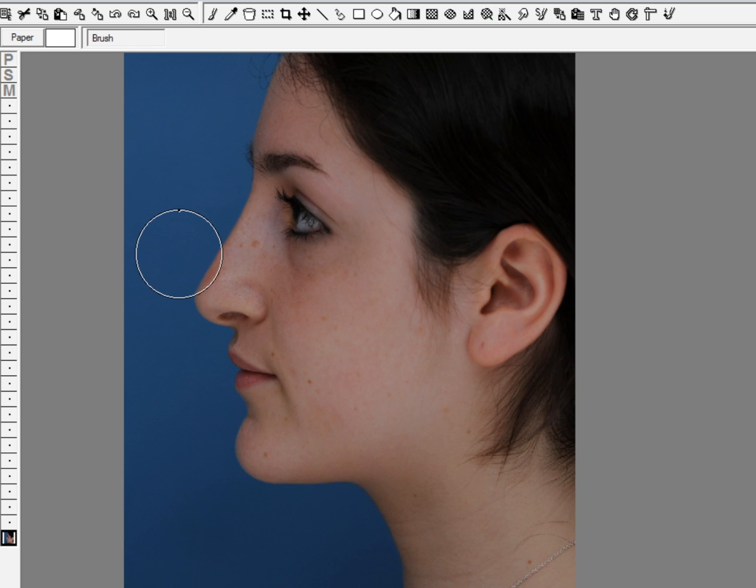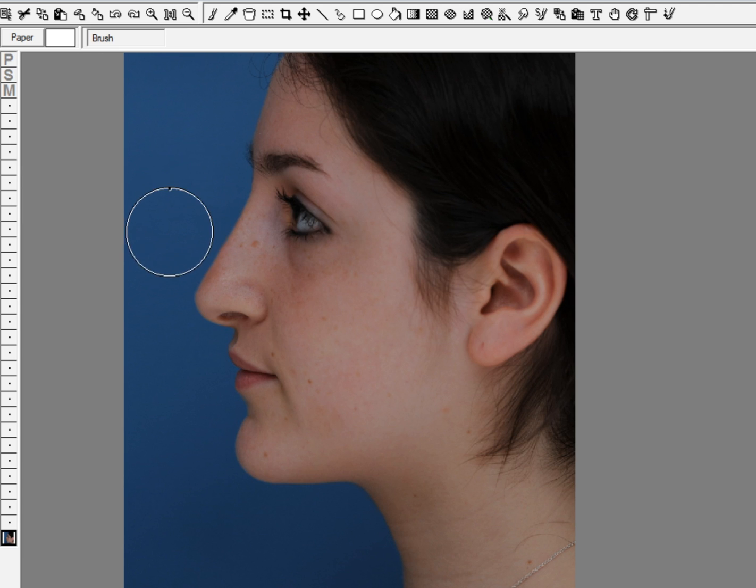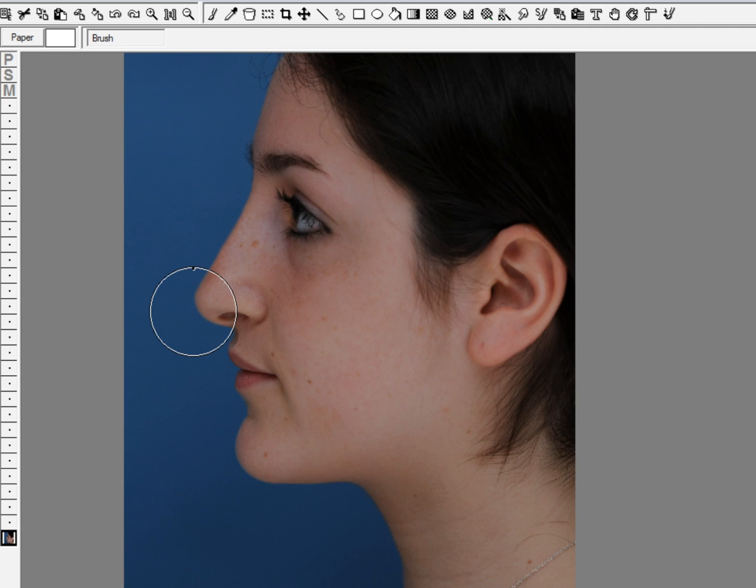If we just did that, then her nose would just look too straight and too long, so we also want to try to create a little bit of a shorter look for her. That means the tip should be rotated up a little bit.